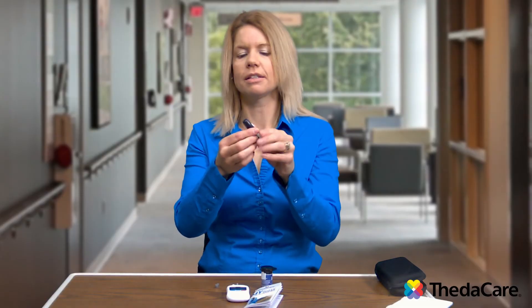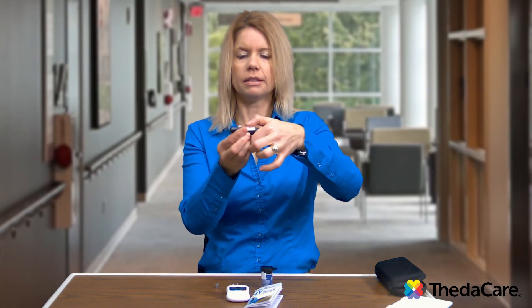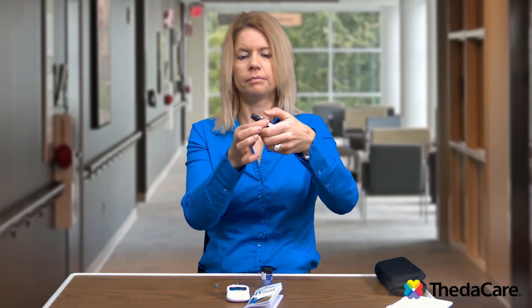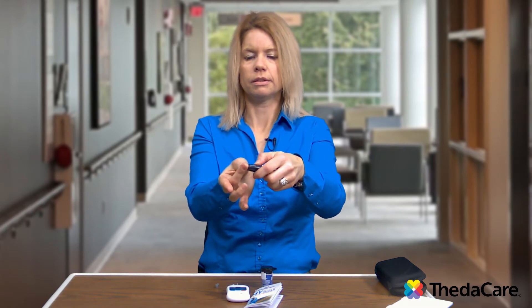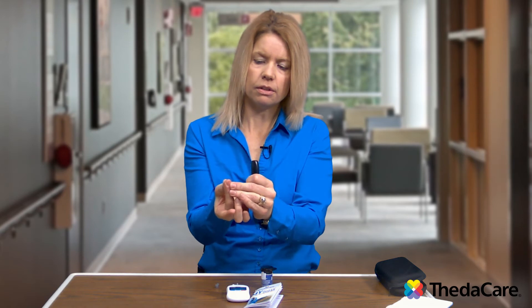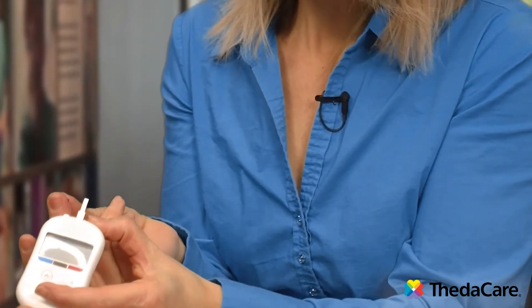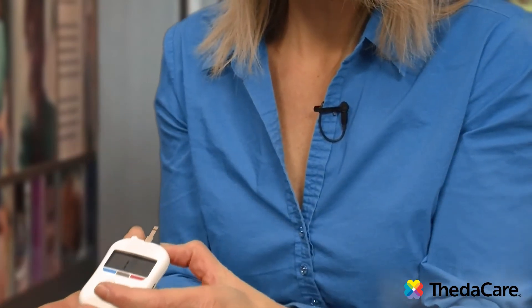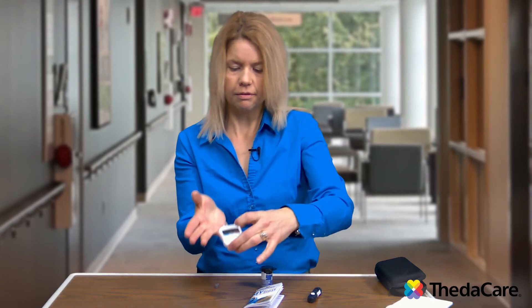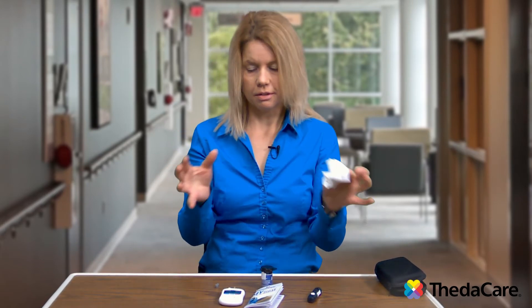So you're going to take your lancet device and find the finger you're going to poke. I'm going to take my button, pull it back until I hear it click — so I know it's set and ready to go. I'm going to take my finger, hit that trigger button, pull it away, give it a little squeeze, and you can see I have a little drop of blood. It does not take much at all to check your blood sugar. I'm going to take that blood, put it at the edge of the test strip — it wicks across — and now in five seconds it will give me a glucose reading: 87. Normal glucose range is 80 to 130, and that's what your target is for.